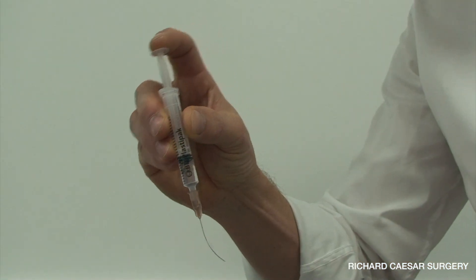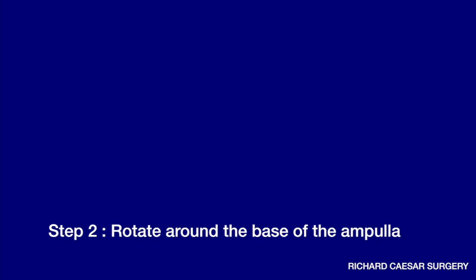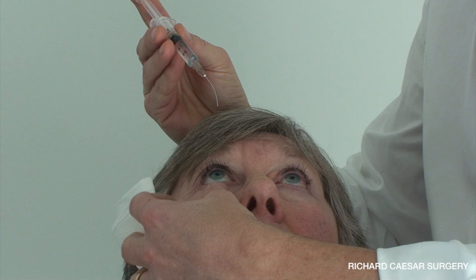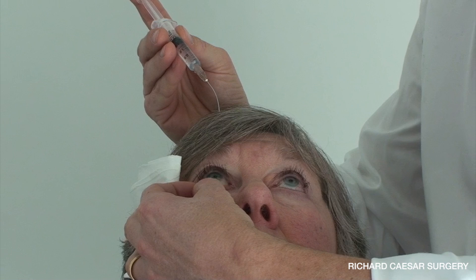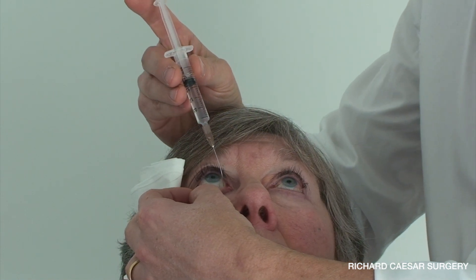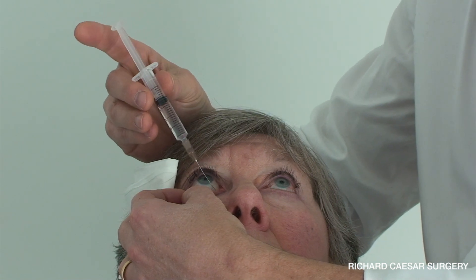Understanding the pronation and supination and this change of grip is essential. The key is simply to balance your hand upon your patient's head, thus giving you great stability. The lower lid is obviously put on to stretch, and you've already checked that the patient's punctum isn't stenosed on the slit lamp.